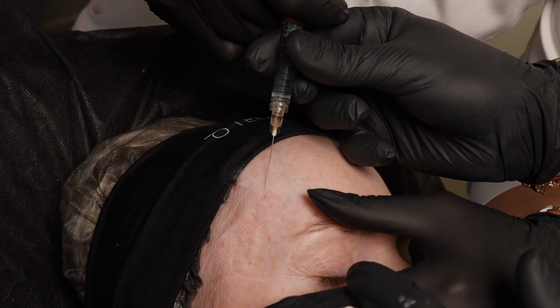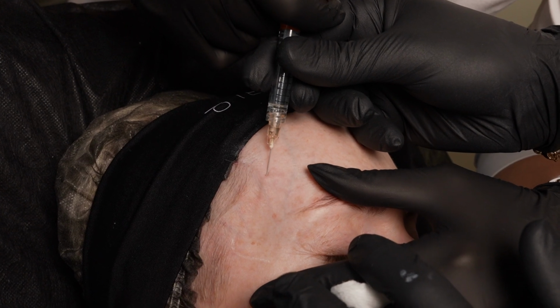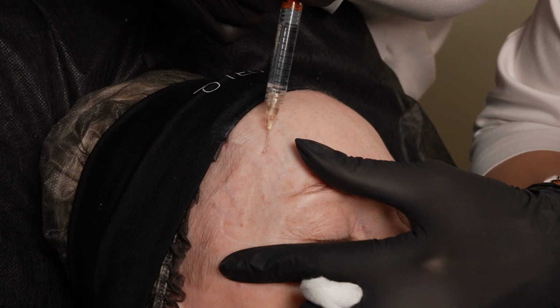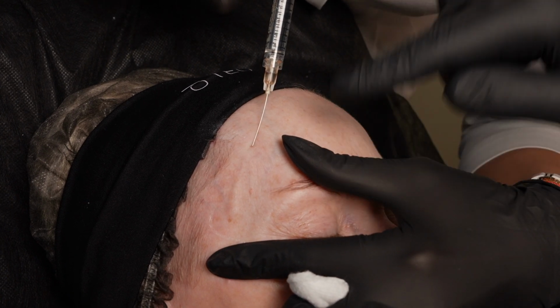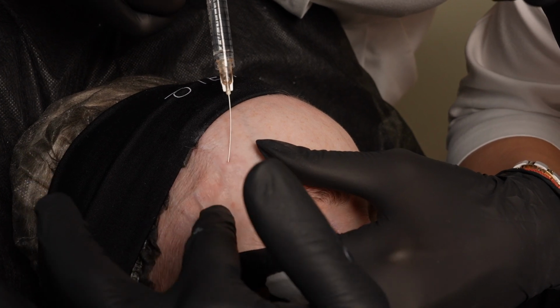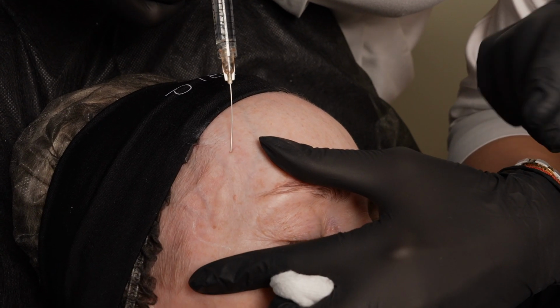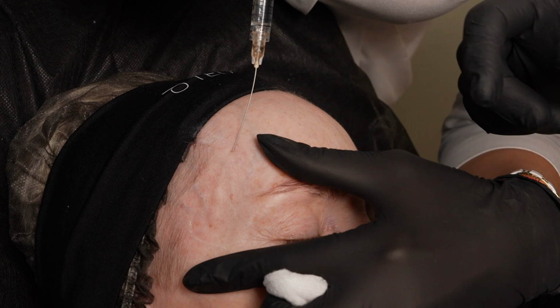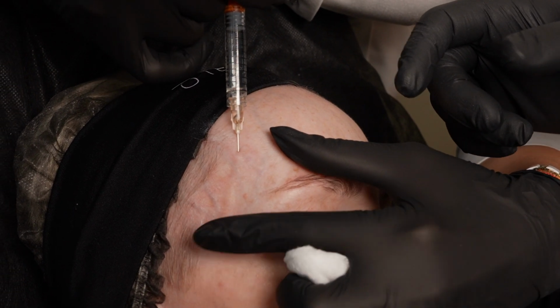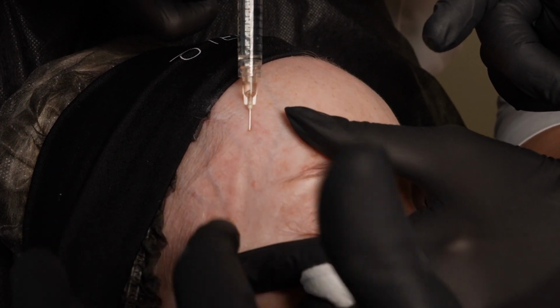Then come again. Inject. When you go up, inject less because we don't want too much volume here. We want volume here. Don't go there. Again, give more volume here.